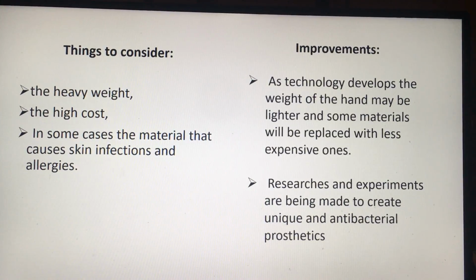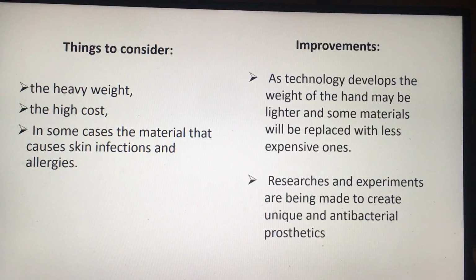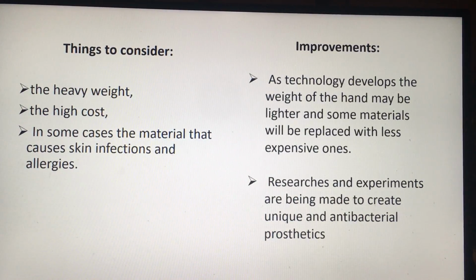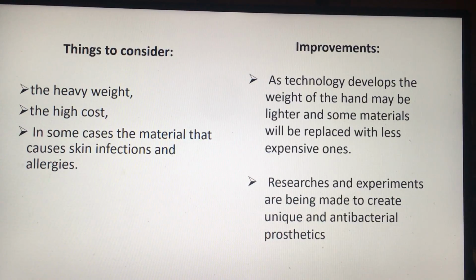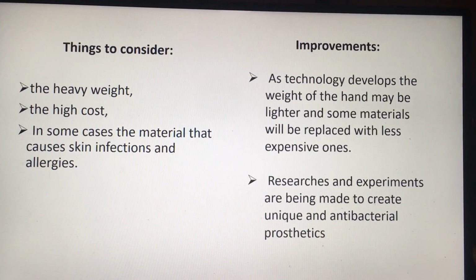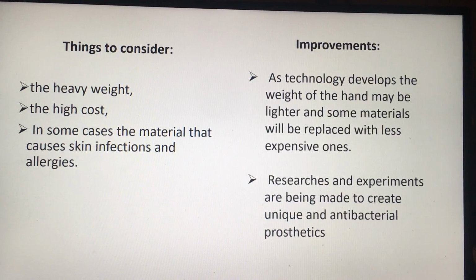In different countries, there is a large number of people with special physical needs. EMG devices are very important for these people to feel normal in their everyday life. But there are also a lot of other advances that need to be made to improve the cost efficiency and the weight of these functional prosthetics. With the advancement in technologies, amputees have more options to best suit their lives.